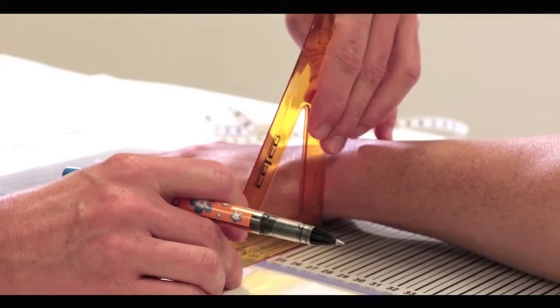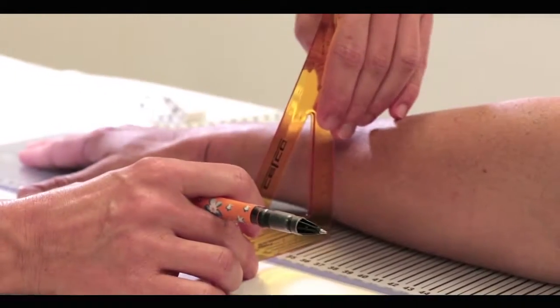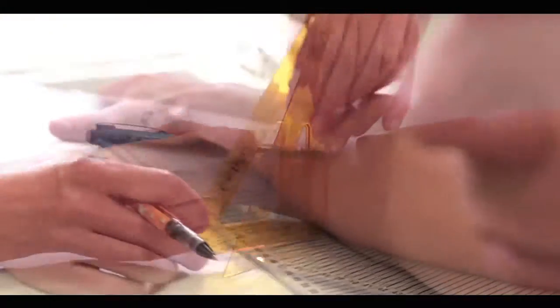Repeat on the radial or thumb side of the arm. Again, using the same zero point, in this case being 24.5 centimeters on the board.